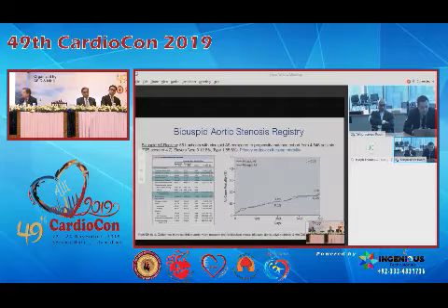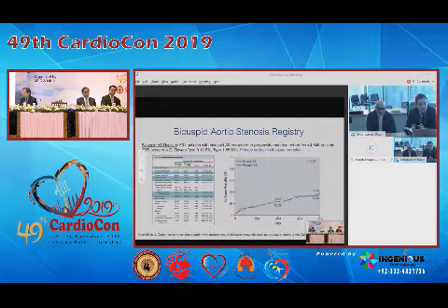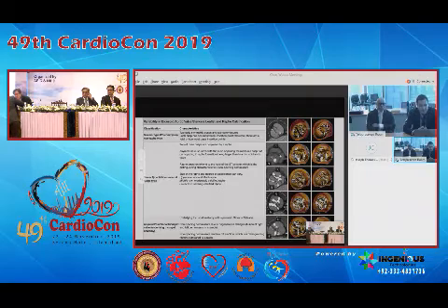And of what we have, at least in this trial here, published in the Journal of the American College of Cardiology, patients with bicuspid anatomy who undergo TAVR versus tricuspid anatomy often have more conversion to surgery, more aortic root injury, more requirement of second devices, and significant paravalvular regurgitation. Yes, their mortality might be similar between the two groups, but there are significant implications for this group. And like I said before, there's big variability in terms of bicuspid anatomy.